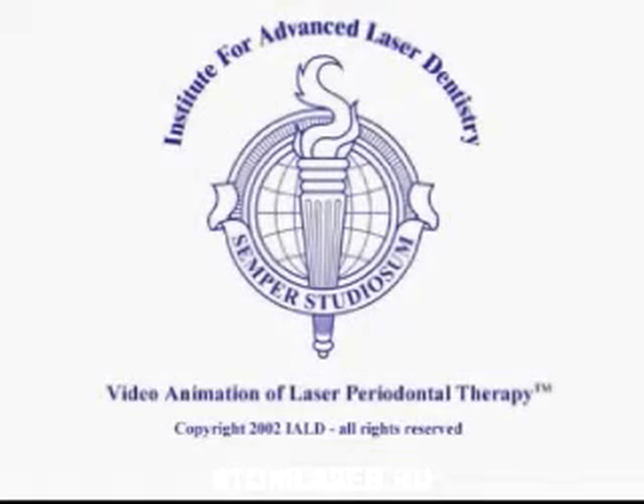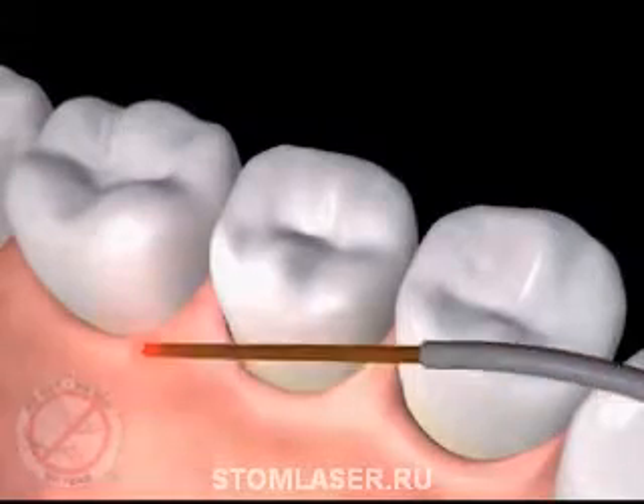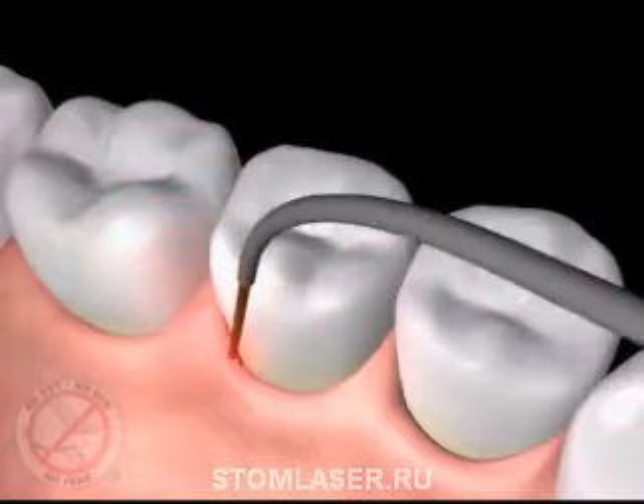This is the video animation of the FDA-cleared periodontal procedure called LANAP, an acronym for Laser Assisted New Attachment Procedure.